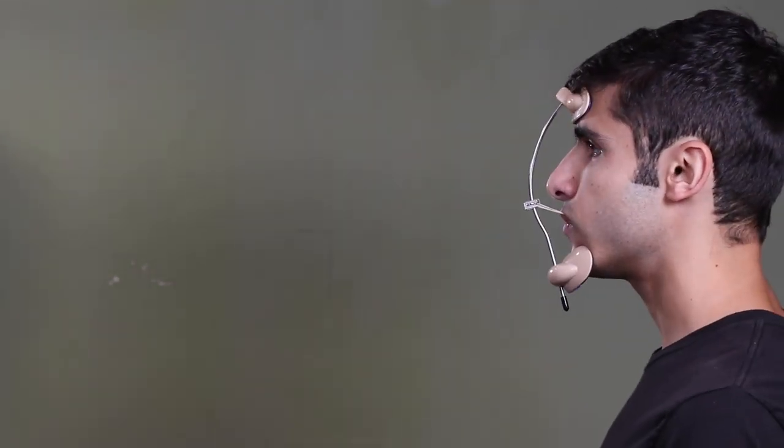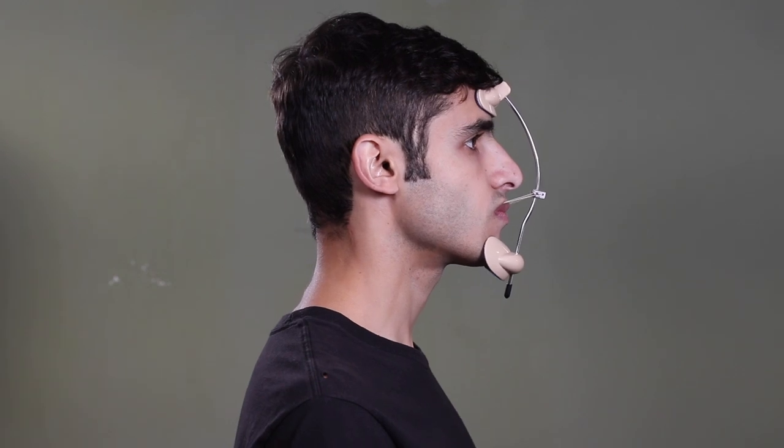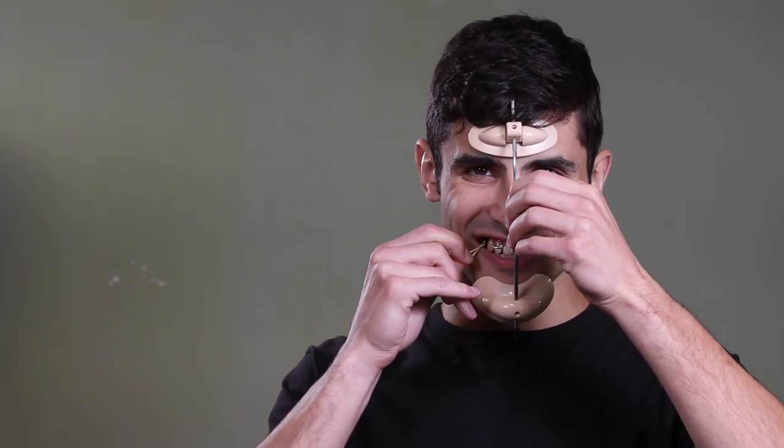So let me demonstrate how to take it on and off. To take it off, you just unhook this elastic, and then you unhook this elastic, and there it is.